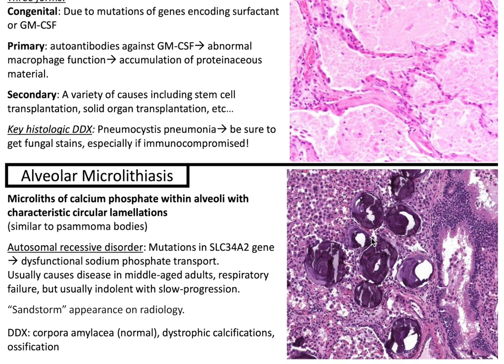It has a sandstorm appearance on radiology, and your differentials include corpora amylacea, which is normal, dystrophic calcifications, and ossification.